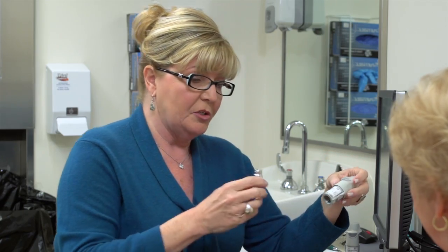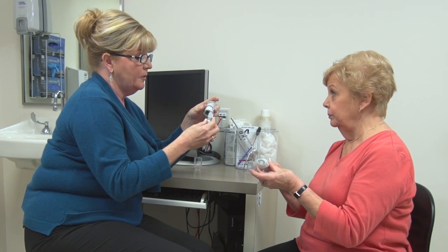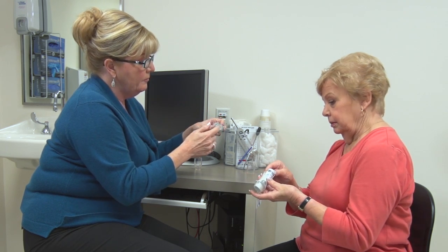To load the medication, take the small canister and insert the top end into the device. There is a little pin — it is a little hard to push in, so use the heel of your hand. When it's loaded properly, it will stick out about an eighth of an inch, and that's correct. Loading the medication canister may be difficult for some patients with poor dexterity or hand pain. These patients may require assistance from their pharmacist or a family member to properly load the canister.